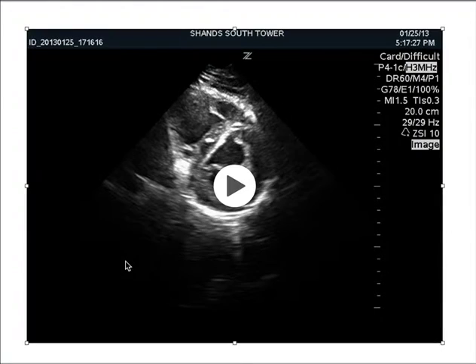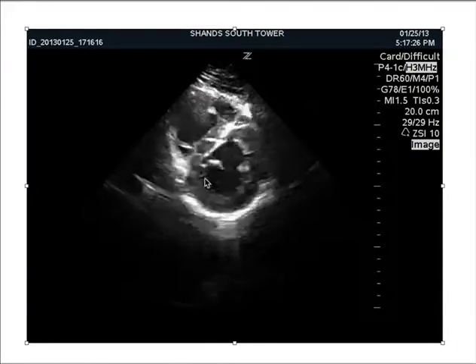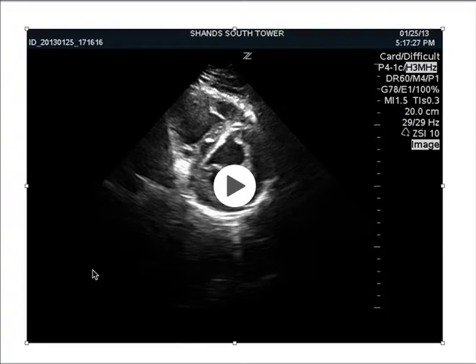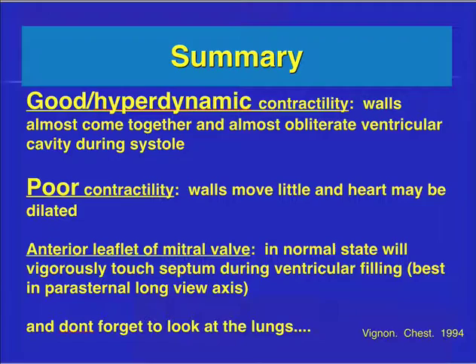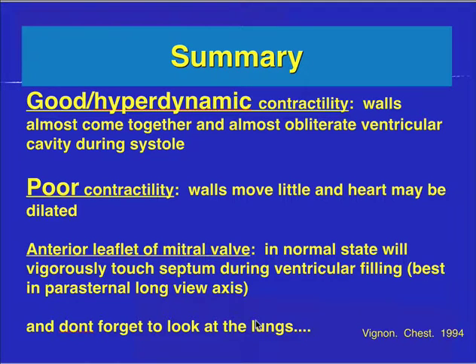To close out: here's a good normal short axis view with papillary muscles visible. Remember, you're looking for hyperdynamic or poor contractility. Short axis papillary muscle level is preferred, but long axis can also be used. Don't forget to look at the lungs — that's one of the most important things. You can also assess the inferior vena cava and CVP, using LV function as just one component of the full patient evaluation.